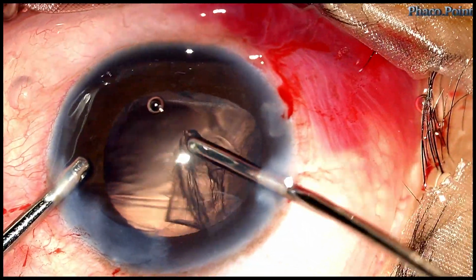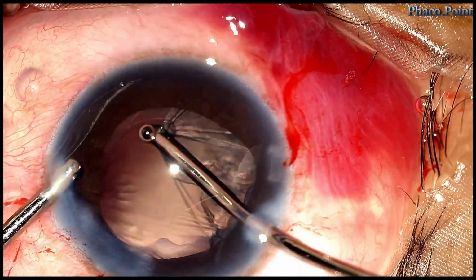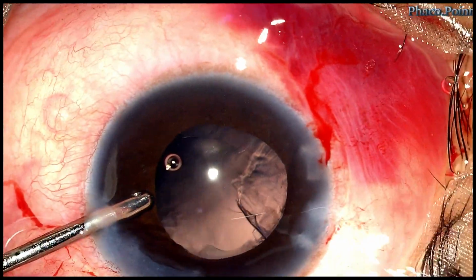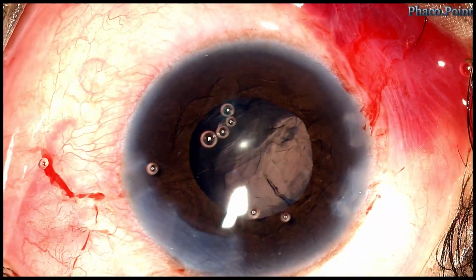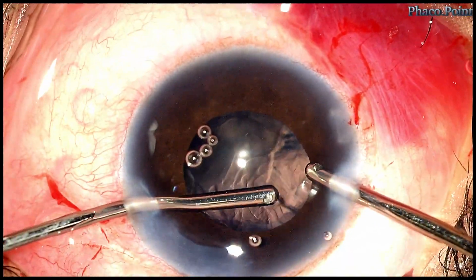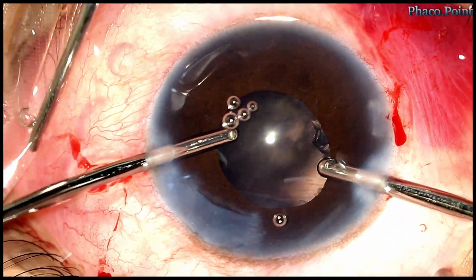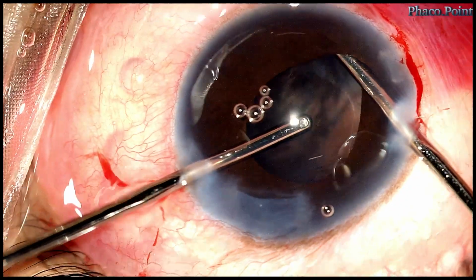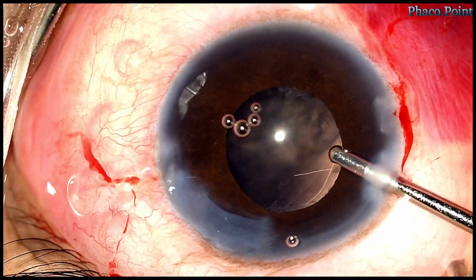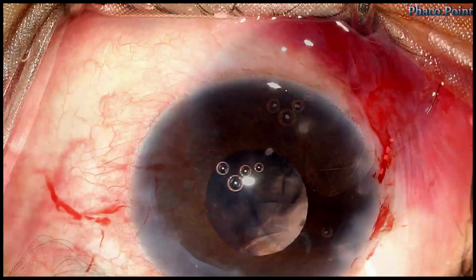A viscofluid exchange is extremely important, especially in compromised cases like this, because you never want any accidental shallowing of the anterior chamber, and in this particular case you definitely don't want vitreous prolapsing out to the area of the subluxation like it did so earlier. With this, as you can see, we come to the end of the cortex wash, and you will note that we've managed to complete the cortex wash without any further disturbance of vitreous.